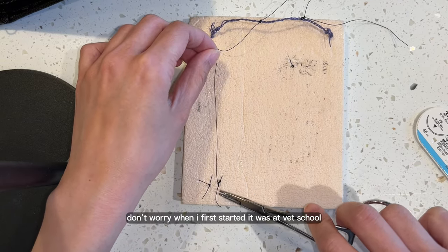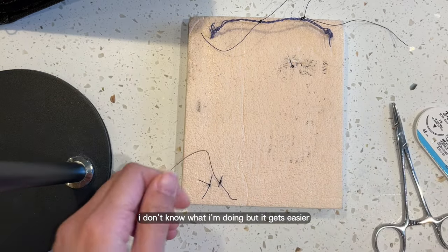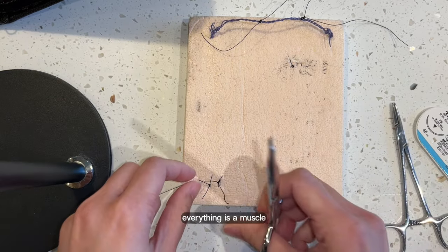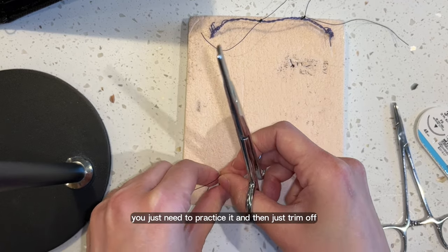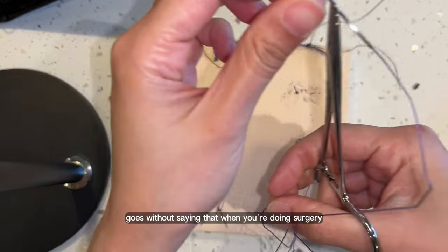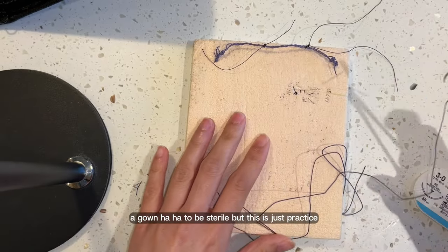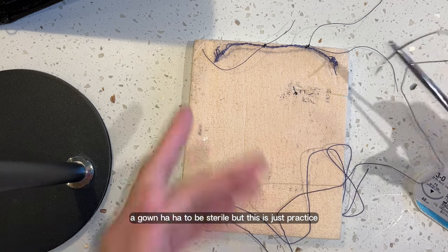Don't worry — when I first started at vet school, I was very like, 'Oh, cat-handed, I don't know what I'm doing.' But it gets easier. Everything is a muscle — you just need to practice it, and then just trim off. Obviously it goes without saying that when you're doing surgery, you need a pair of gloves and also a gown to be sterile. But this is just practice.